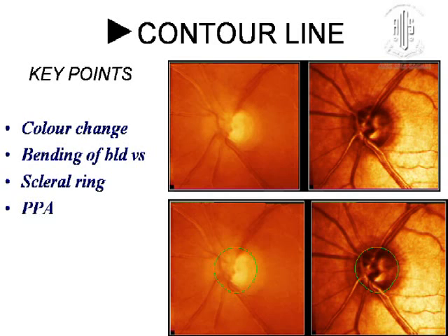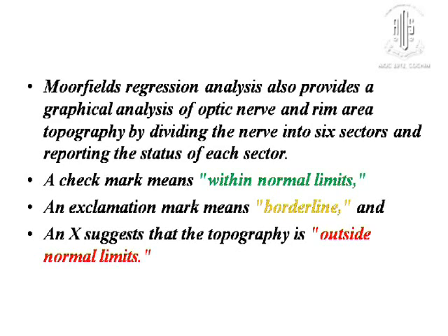Since there is no time, I will not go into it. Moorfield regression analysis is another thing which Dr. Susmita and Rajul will be dealing with. And of course the HRT3 doesn't have Moorfield's.